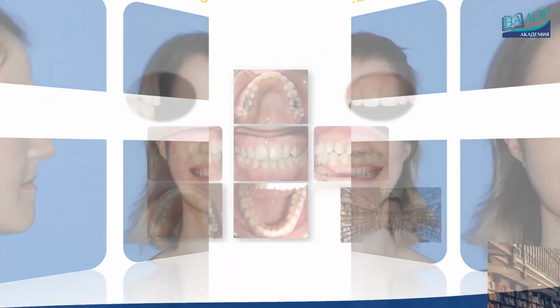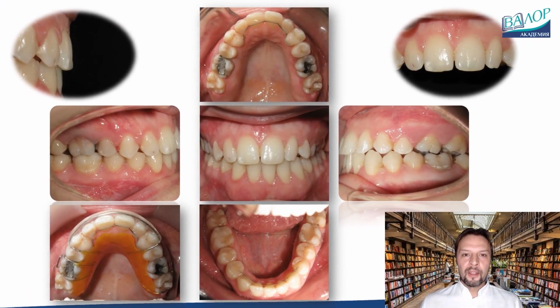I wish you could see what happiness the eyes of these patients radiate, but maintaining confidentiality does not allow this. Intraorally, the upper premolars which have replaced canines occlude in class 2 because the mandibular right first premolar replaces the canine. Thus, the canine replaces the missing incisor, and the middle of the mandibular dental arch is between the right central and lateral incisor and coincides with the upper midline.